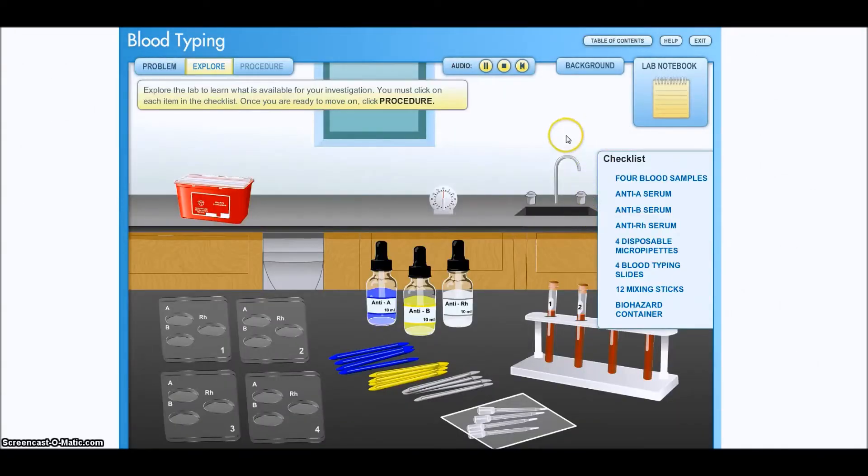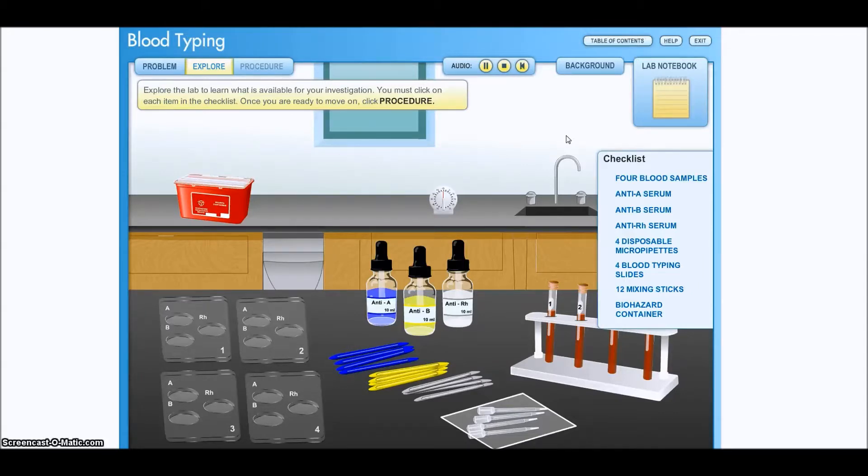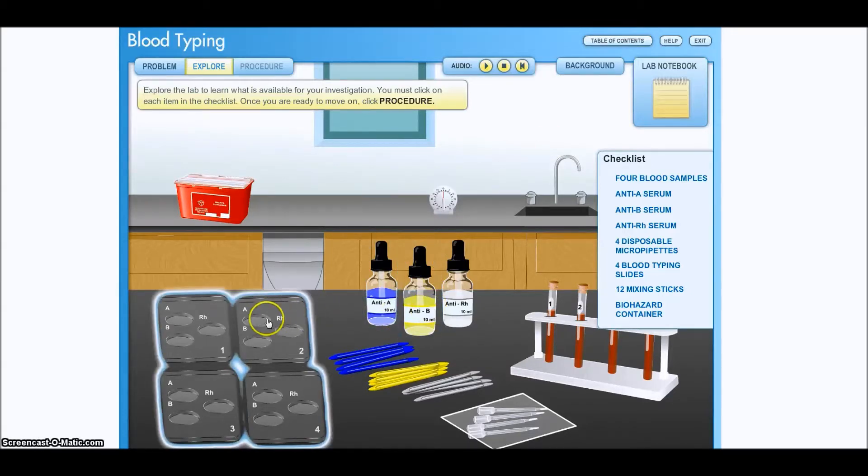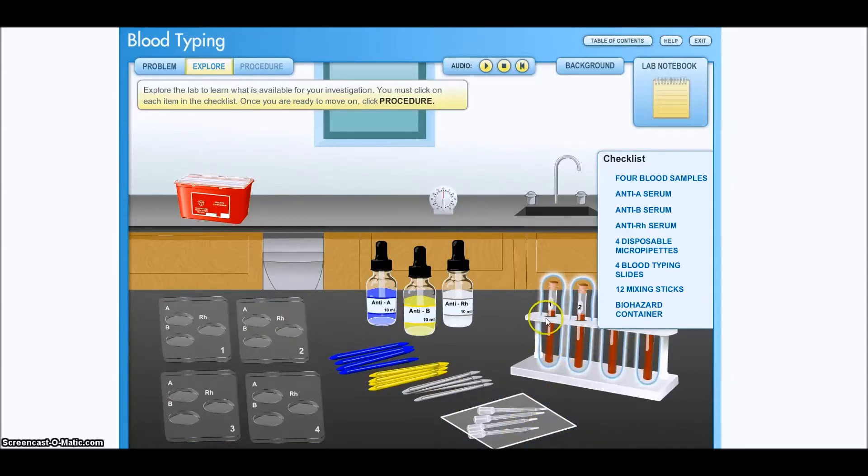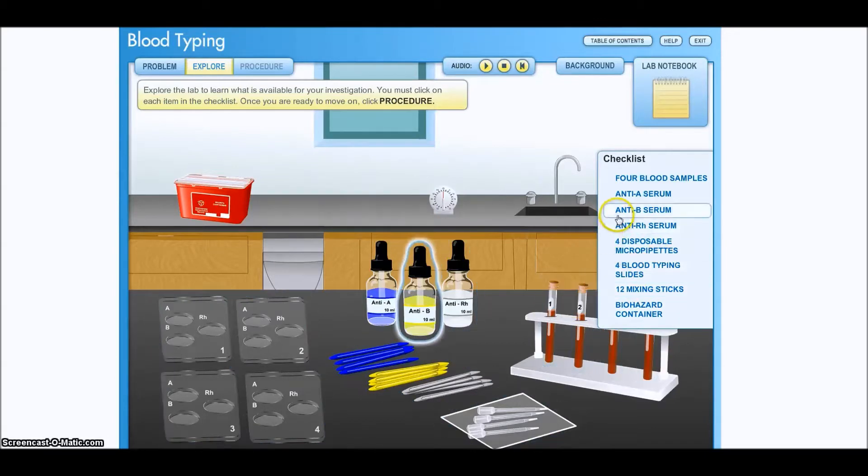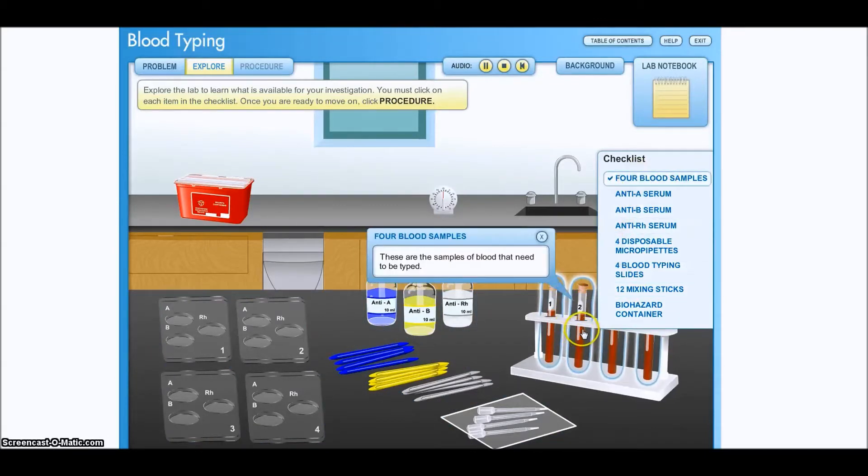Explore the lab to learn what is available for your investigation. You must click on each item in the checklist. Once you are ready to move on, click Procedure. So the purpose of this is to determine or learn what all the different sources of materials are. These are the four samples, four blood typing samples, right here.